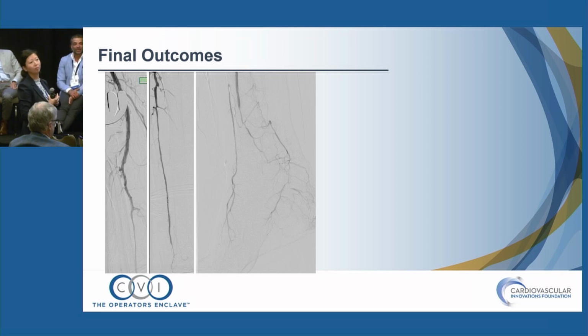How do you do it at your puncture site downstream? So the peroneal is unfortunately not a compressible area. And you can see in this third image here, I actually did balloon tamponade of the site, because remember, I sized up to an 035 microcatheter. So in the peroneal or in the prox AT, I typically do balloon tamponade.